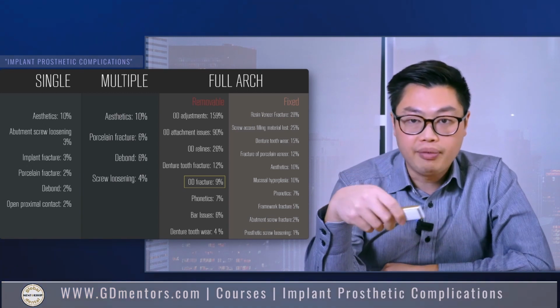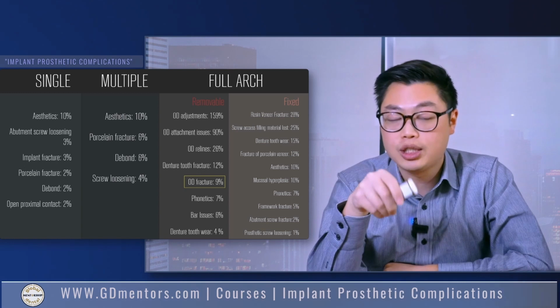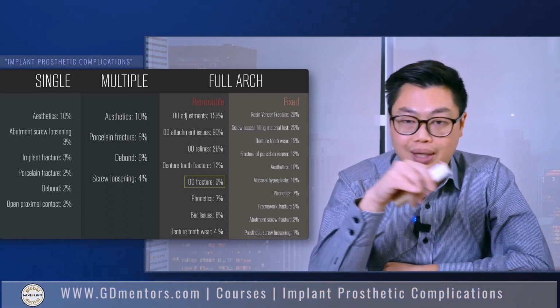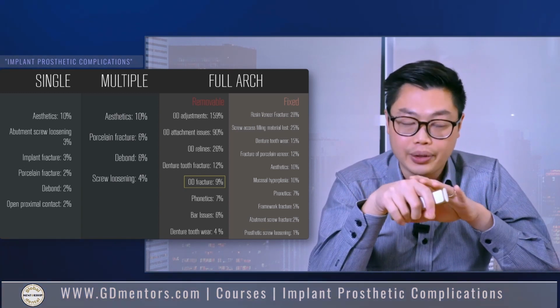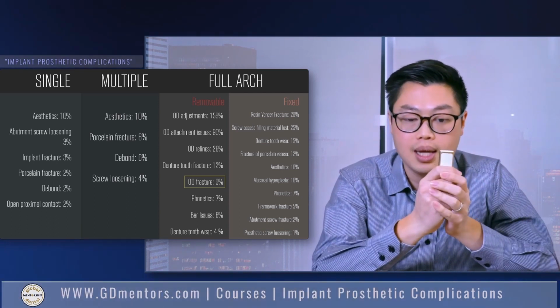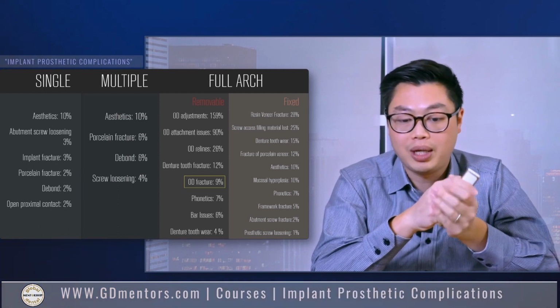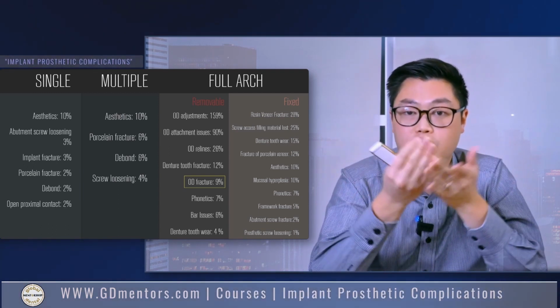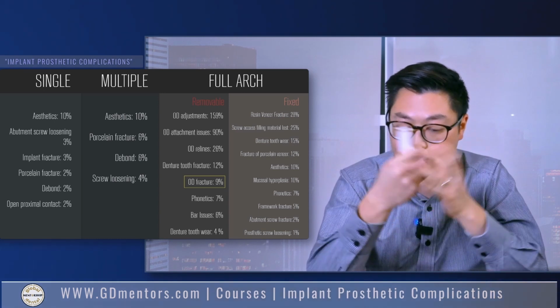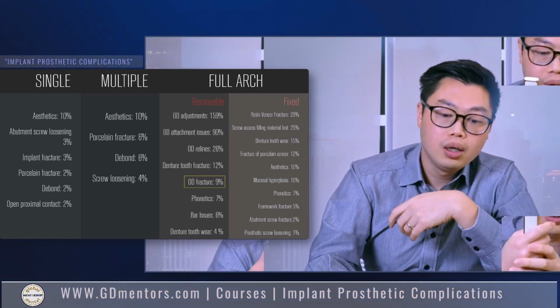The major benefit of the metal substructure is so that if things crack, things are still joined together. So it's easier to repair and things aren't completely separate in two pieces. If there's no metal frame inside, sometimes the patient will come and give you literally two pieces of a denture. So it's more of a catastrophic, traumatic break.